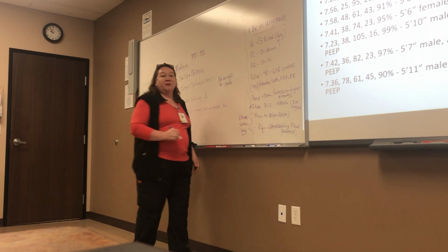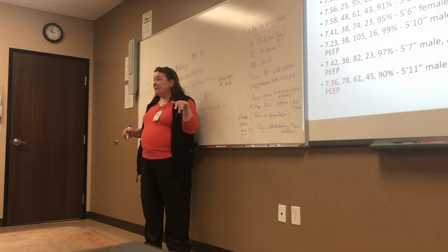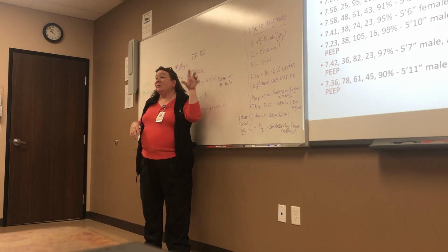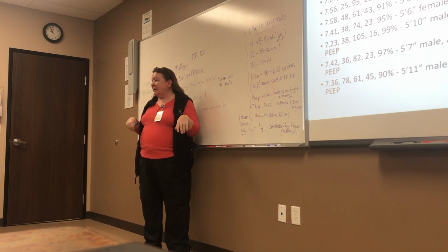You cannot change the flow in pressure control, because your volume varies with your pressure and your compliance and resistance, so your flow has to vary, because those two go hand in hand. So if I gave you a pressure control setting and told you to set a flow, would you do that? No, because you can't do that in pressure control.